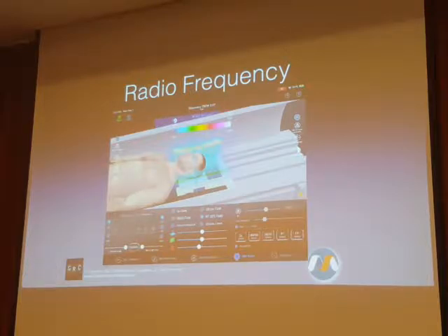Two reasons. One, because we have to get superior or inferior to the location that we're imaging to get to where those transmit rings are. And then we need to get radially. The power is greatest close to the wall of the bore.